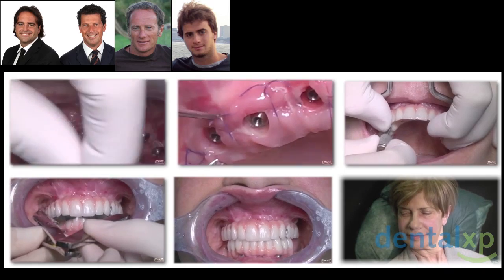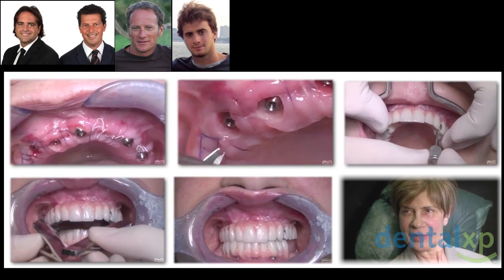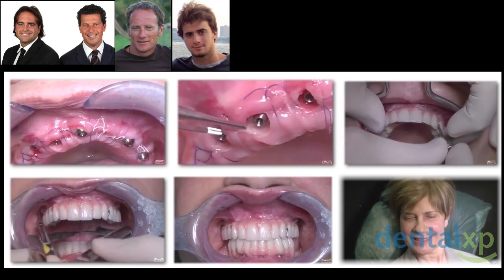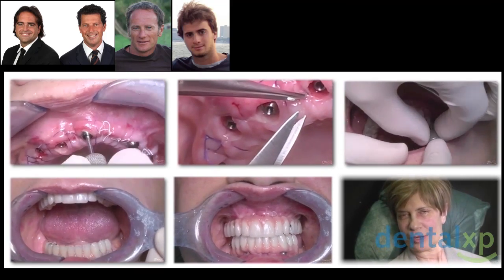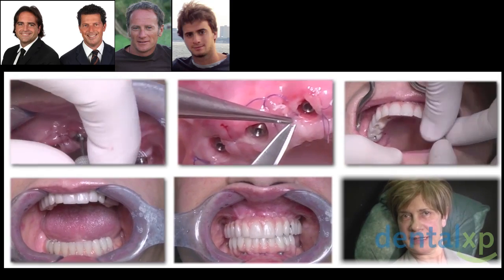You can see we remove the healing abutment — this is not Armando but it's another patient, but the protocol doesn't change. We remove the healing caps, we remove the suture, and we are trying the upper and the lower provisional.